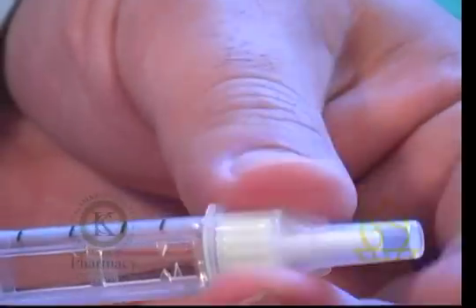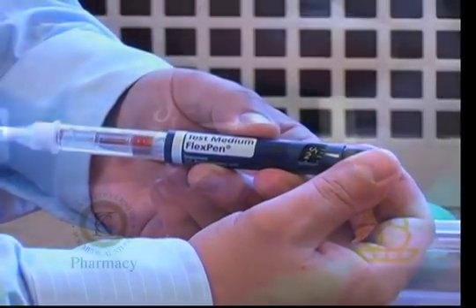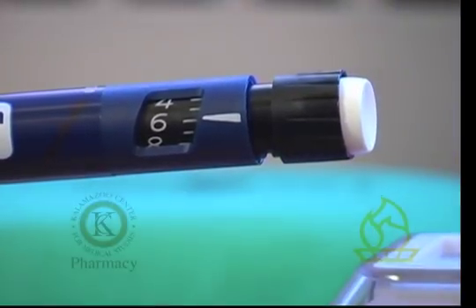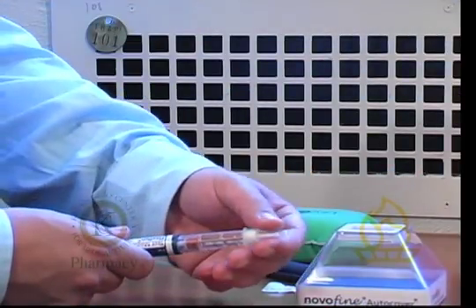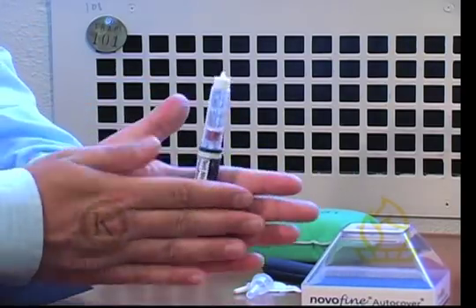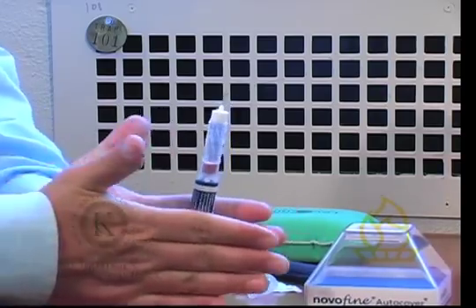Prior to any use, the device must be primed by dialing to two units. Dial to six units for the first time use. Remove the caps to expose the needle. If you are using cloudy or long-acting insulin, you must roll the flex pen in your hands for about five seconds.